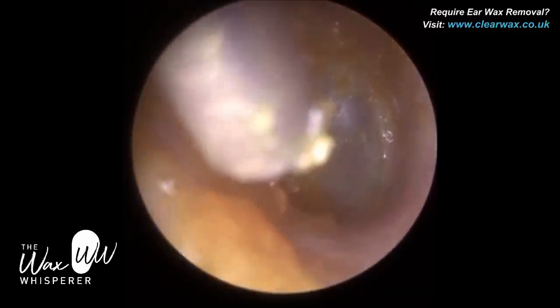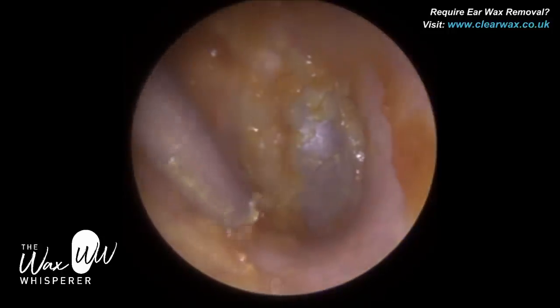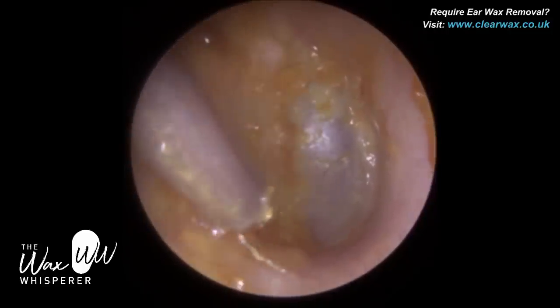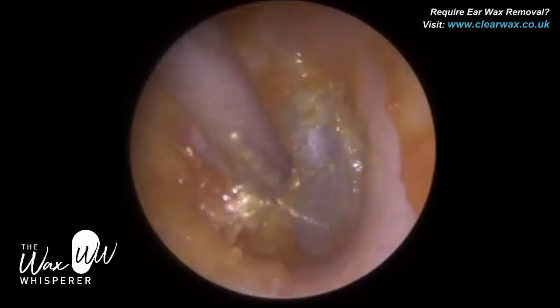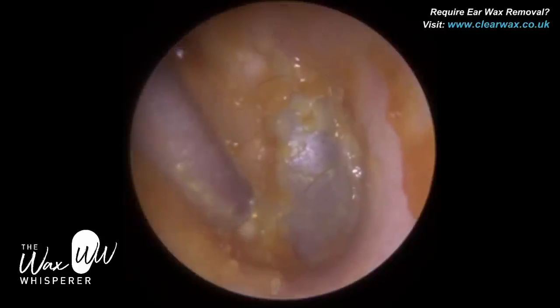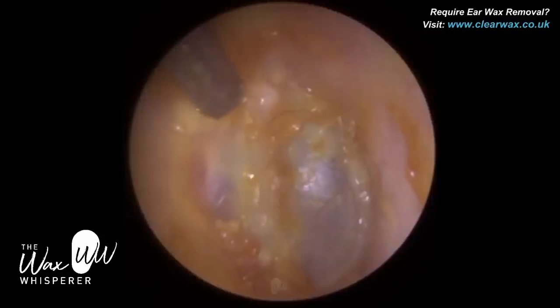The anterior recess is the front part of the eardrum. In the case of the right ear — so this is the right ear — we're talking about the right-hand side of the eardrum. About half a centimetre away from the eardrum, the ear canal narrows — that's called an isthmus — and that creates a recess. There are normally a couple of recesses: one anteriorly at the front part of the eardrum, and typically also inferiorly at the bottom of the eardrum. Like a trench. Though it's not always the case — everyone's ears are different.